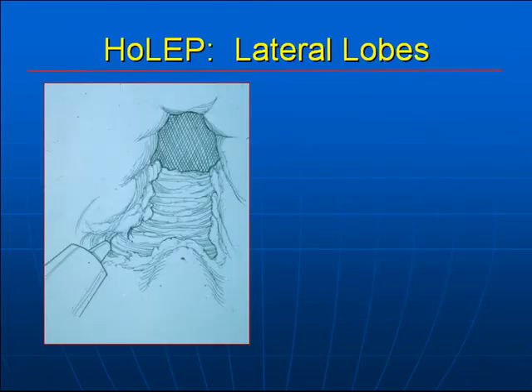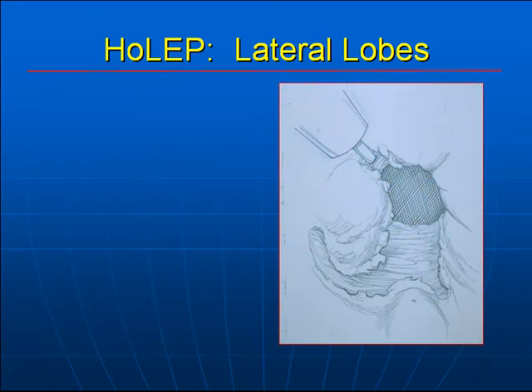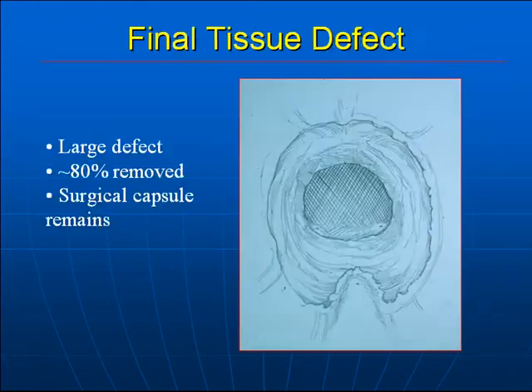The lateral lobe is incised at the apical margin from the 6 o'clock to 9 o'clock position on the right lobe, carried down to the surgical capsule. This is connected to an incision on the anterior portion of the prostate at the 12 o'clock to 9 o'clock position. Then in a retrograde fashion, the lateral lobe is enucleated into the bladder. The final tissue defect is large — approximately 80% of the prostate volume is removed, and the surgical capsule remains.